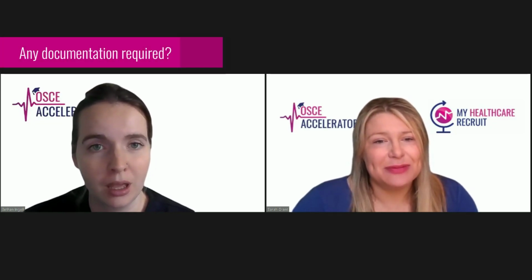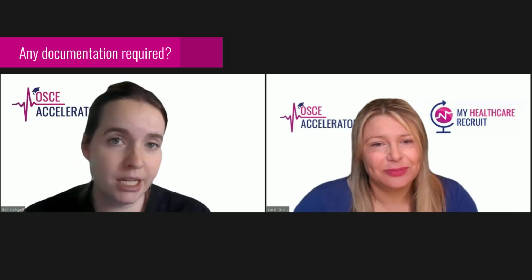Wonderful. How long is this station? How many minutes do you have to complete it? It's quite a quick one. It's 8 minutes, but you should be finished in time. Okay, wonderful. Any documentation required for the station? The documentation itself is quite straightforward. You're just going to have quite a basic chart. You'll need to take 3 readings from your patient. So you just need to write those down, and also you'll need to take the highest reading.